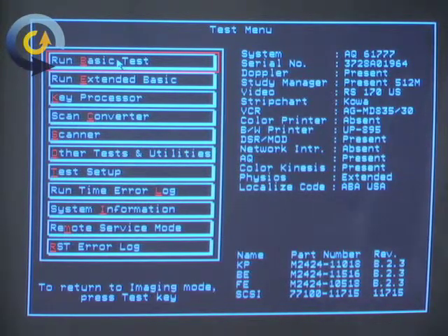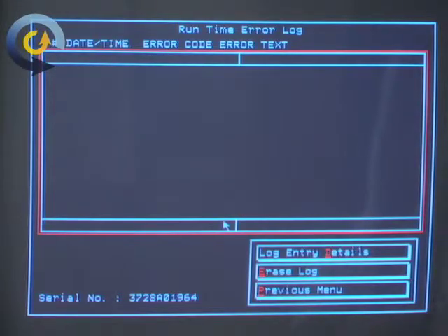What we recommend is if you're running the system for the first time, there are two segments below that. One is runtime error log, and the other is the reset error log. If you were to have an actual error recorded or logged into the system, there would be an asterisk in this field. What we recommend is that if there's an asterisk in the field, go and select that field, and there would be a reporting of whatever error had occurred in the system.